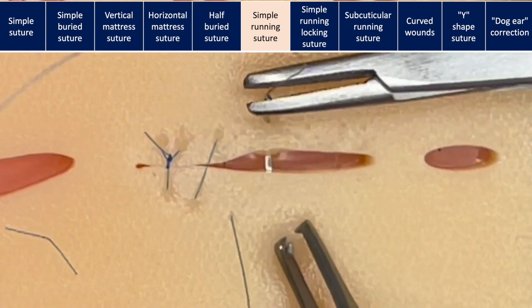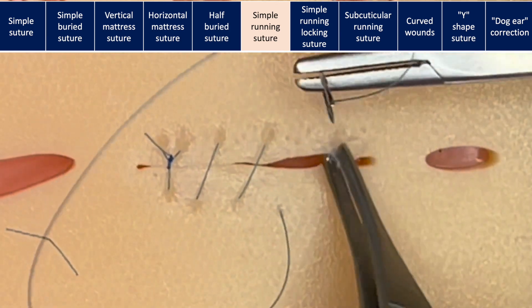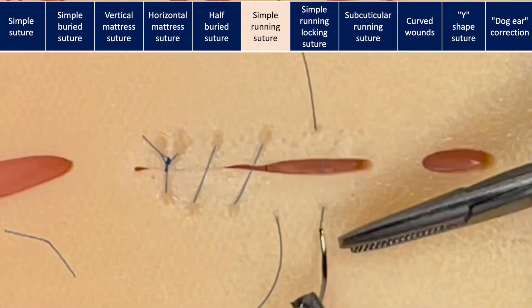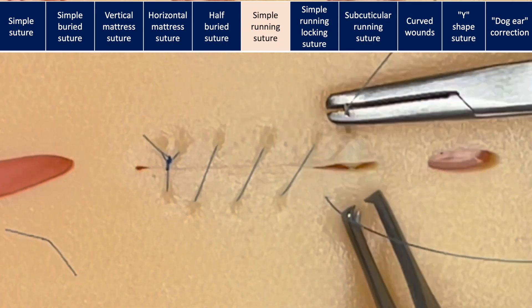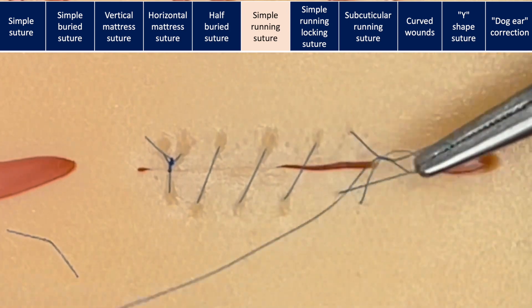The most important thing is to take the exact same bite each time and advance the same amount each time. When pulling up, be gentle — just so that the skin edges touch. Pulling up on the suture very hard will cause strangulation and can cause bad scarring.